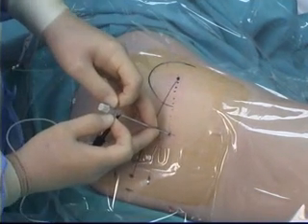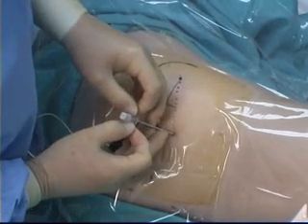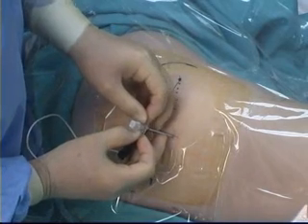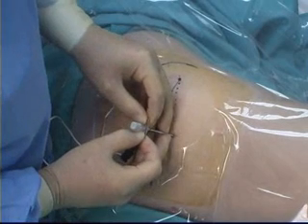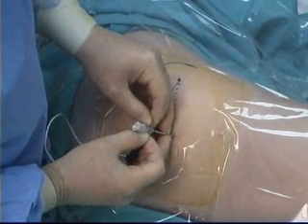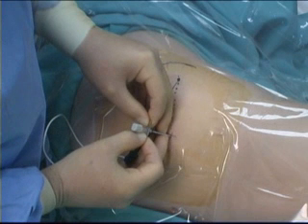A 17 or 18 gauge insulated Tuohy needle, which is attached to a nerve stimulator set to an output of 1 to 2 milliamps, a frequency of 2 Hz, and a pulse width of 100 to 300 microseconds, enters the skin at an angle of approximately 45 degrees. The needle is aimed caudad in this illustration, but if the intended placement of the catheter is cephalad, the needle is aimed 45 degrees cephalad.